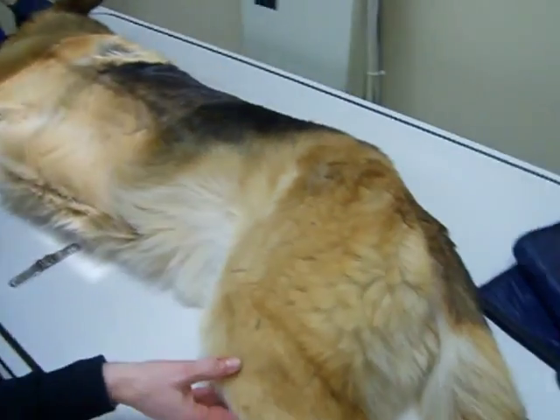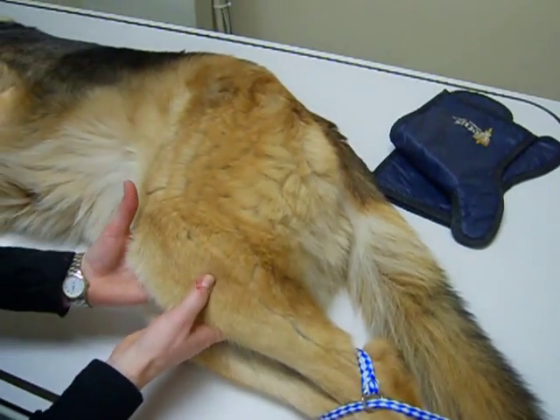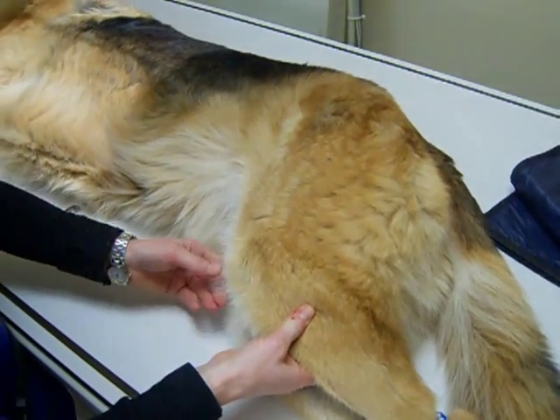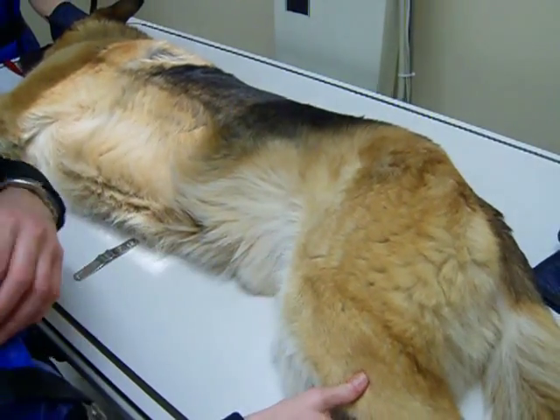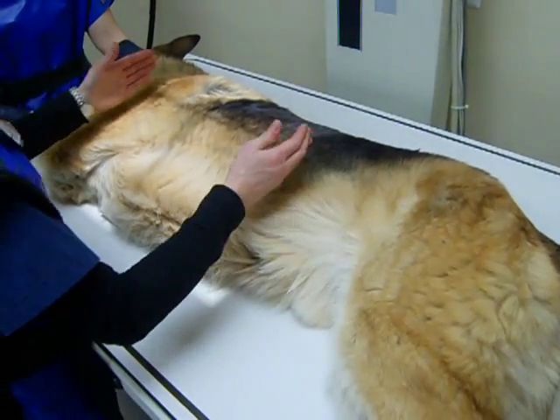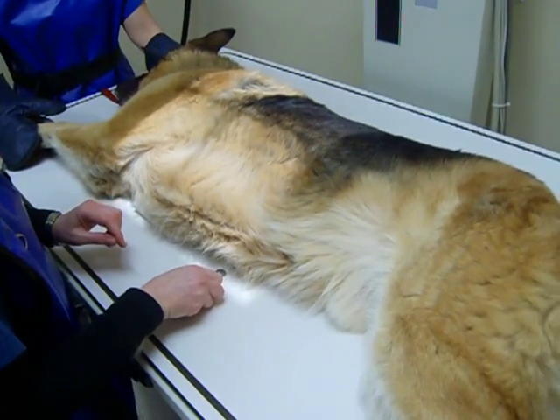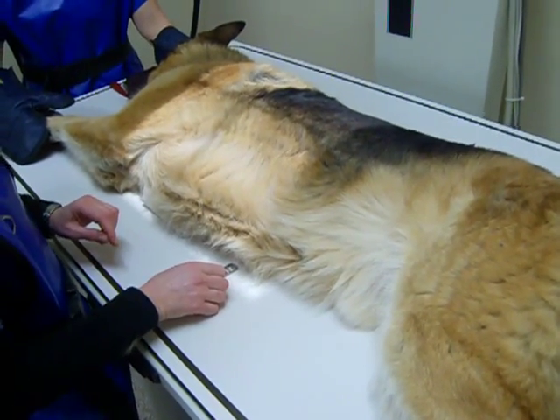I'd pull the hind legs caudally and put a wedge underneath to ensure there's symmetry and to ensure that the femoral muscles aren't obscuring any part of the field of view. Then we'd place our right marker to denote that it's a right lateral recumbent projection.